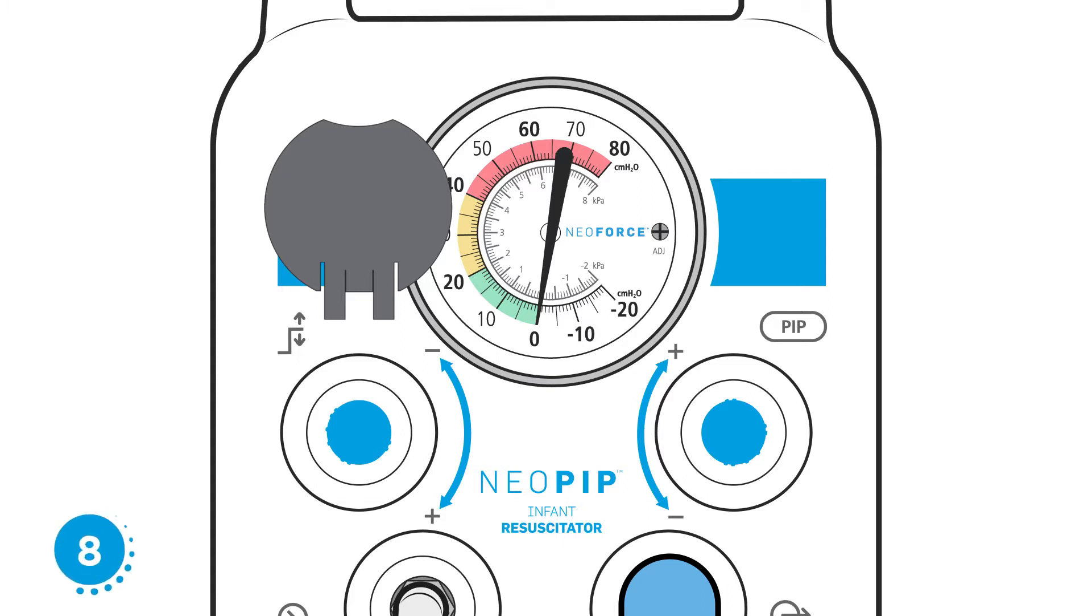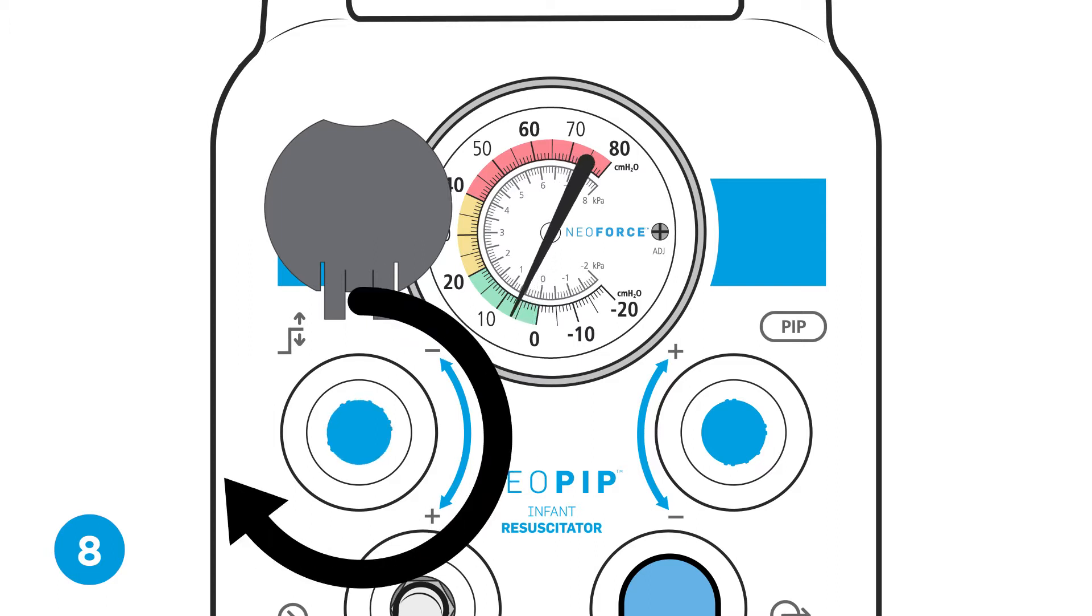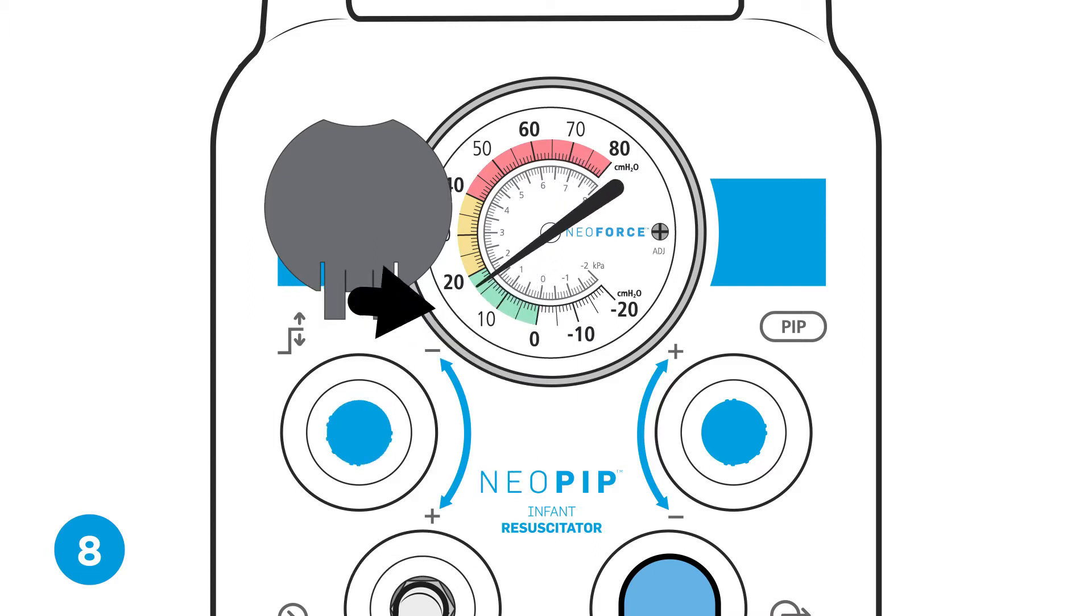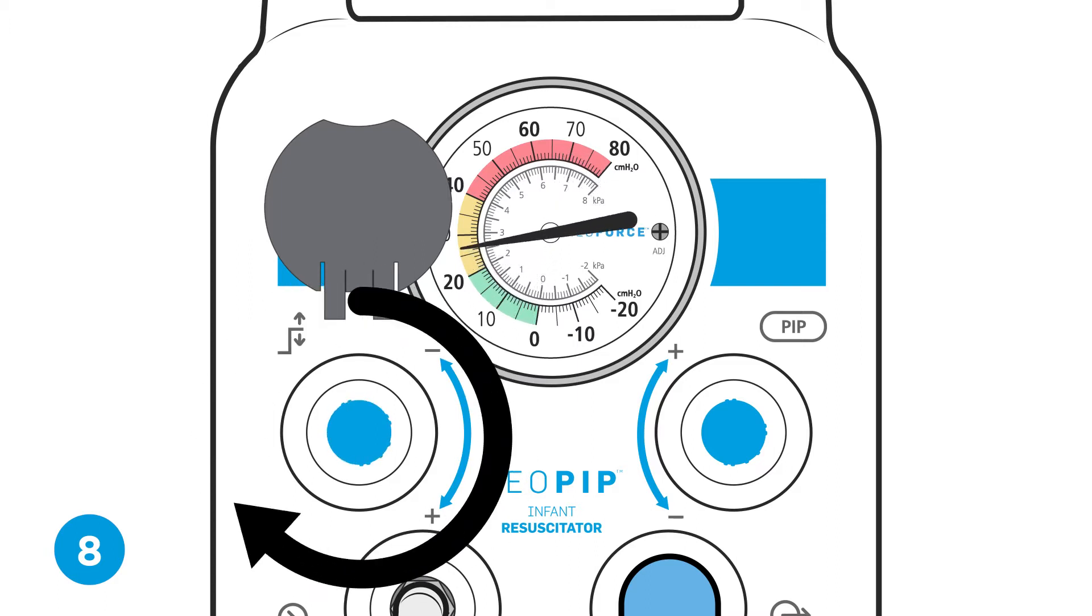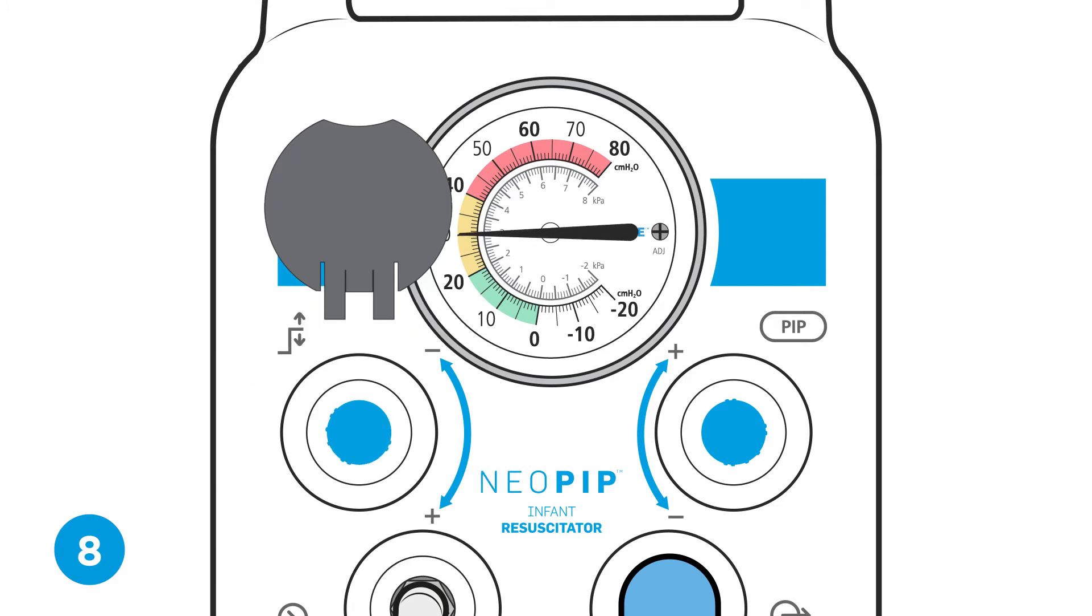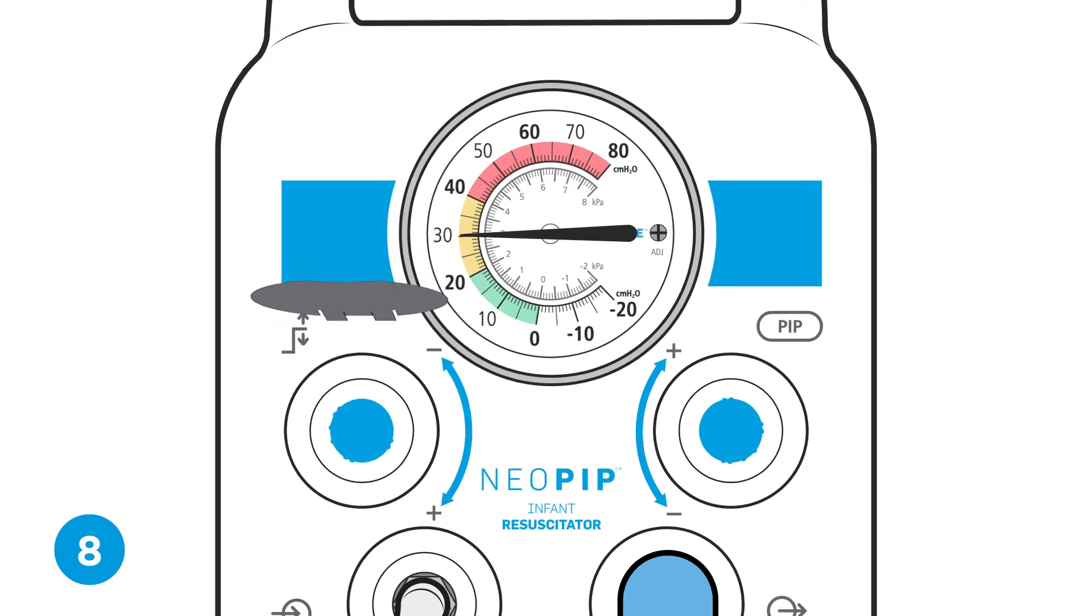Step eight, set the pop-off. With the TP circuit still occluded, turn the pop-off control several turns clockwise to set the desired maximum pop-off pressure.